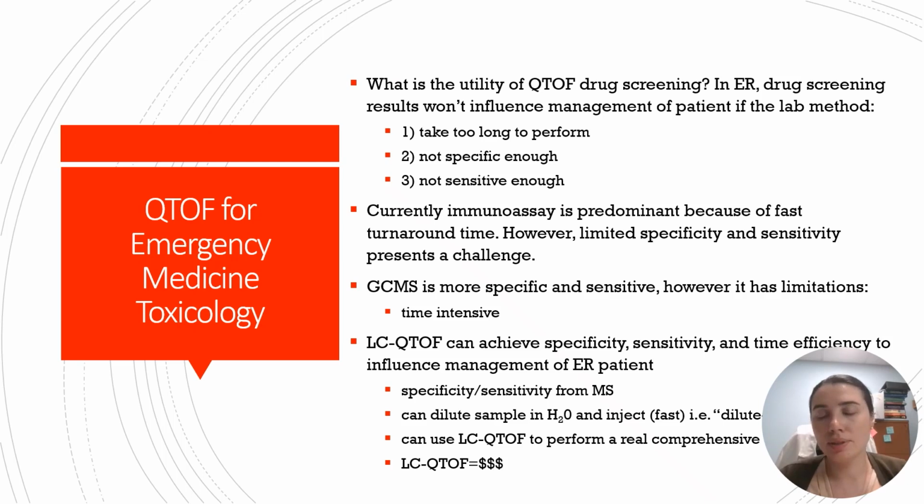So why use a QTOF at all? Well, for us, it plays an important role in emergency and critical care situations. In these settings, drug screening results will not influence management if they take too long to perform, they're not specific enough, or not sensitive enough. Currently, a lot of EDs just use immunoassays because they're fast, but they have very limited specificity and sensitivity.